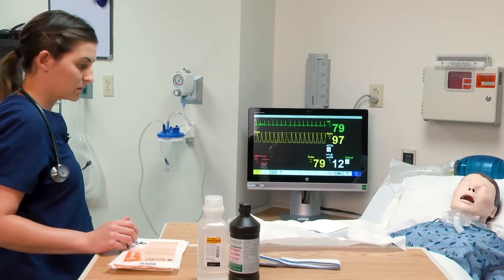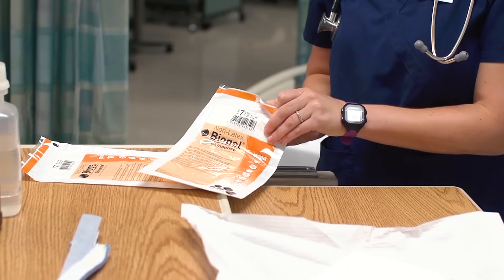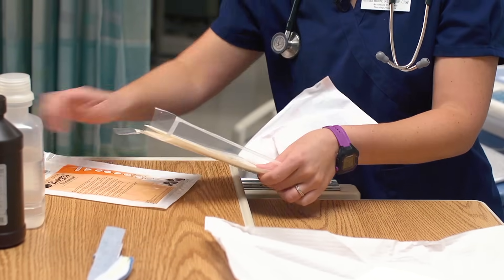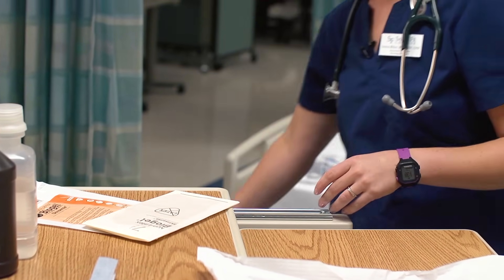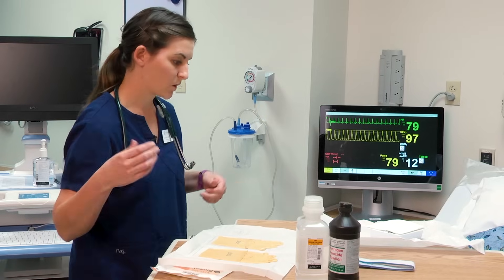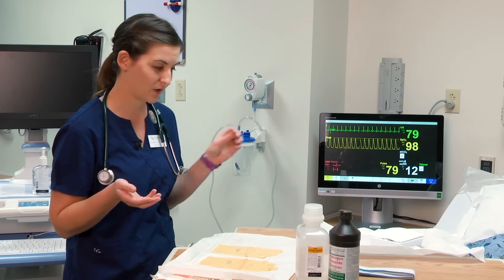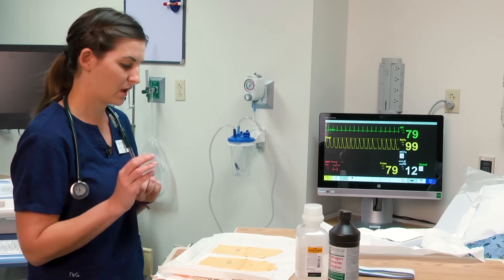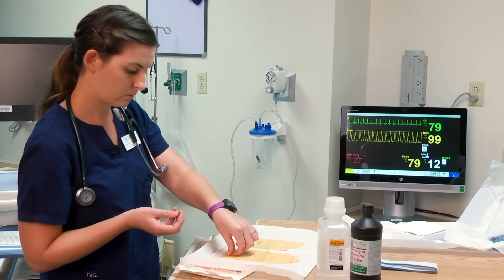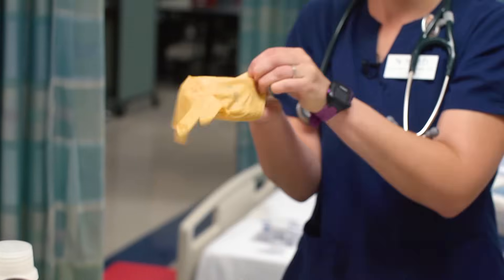I'm going to move this out of my way without turning my back on my field or my patient. I am right-handed so I'm going to put my right glove on first, since I don't have a problem pouring with my left. If you had a problem pouring with your left, you would want to put your left glove on first.